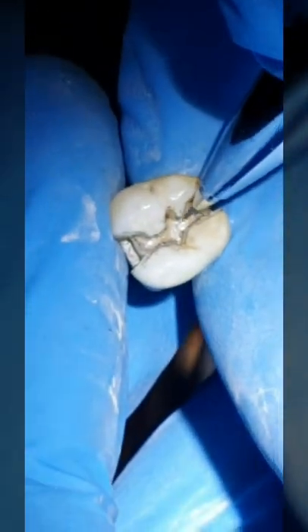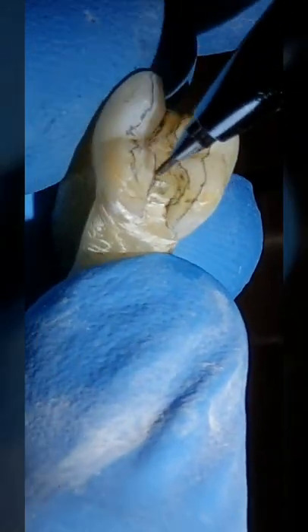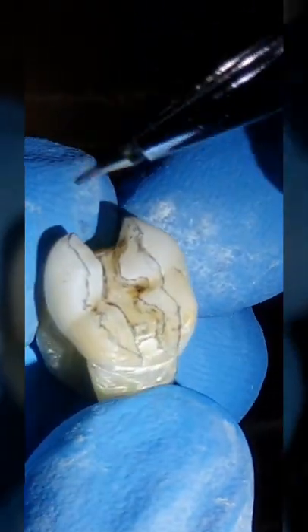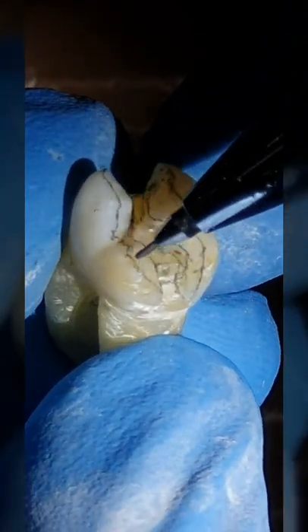Now we will take this and change it into an onlay. According to the internet and some of the pictures in circulation, an onlay, to them, is if you take an inlay and just put a bevel on the occlusal surface without covering a cusp completely. To them that's an onlay. So I have done that by making the bevel, but what was taught to me as an onlay 30 years ago covers the cusp. So I'll go ahead and now convert this to what they call an overlay, which was taught to me as an onlay, but nonetheless these are progressive steps in preparation.